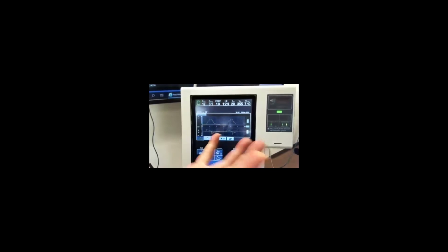What happens? The peak airway pressure will keep going up too, because you're increasing the pressure in the lungs. So if it becomes 30, 35, 40, now we are in a danger zone. A patient can develop pneumothorax. In that case, we may switch to pressure control. She will explain what pressure control means. We have to set the peak pressure, and beyond that the pressure in the lung won't go up. That's called lung protective strategy.